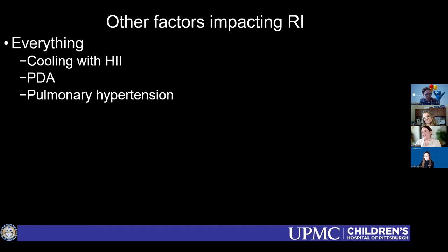I have one quick protocol question before we dive into that. Do you do a Doppler charge on these? That's one thing we've run into with this particular issue. We've been told that, even for a soft tissue vascular anomaly, you can do color on it without having to do an additional charge. But once you do a spectral waveform, it adds that Doppler charge. Do you change anything as far as your billing or coding with doing ACA Doppler?